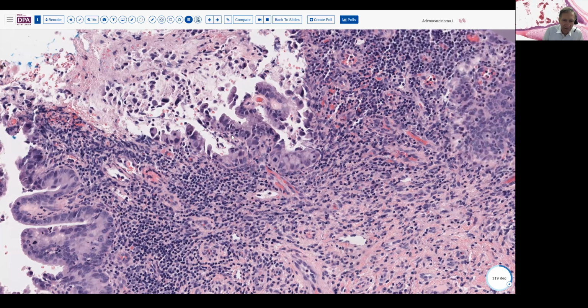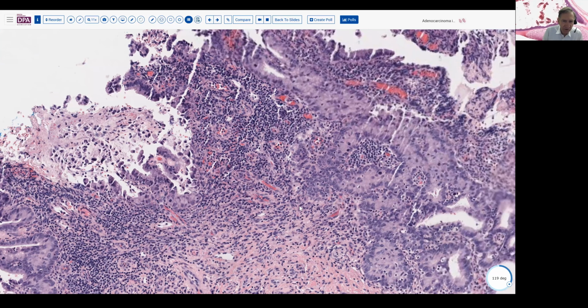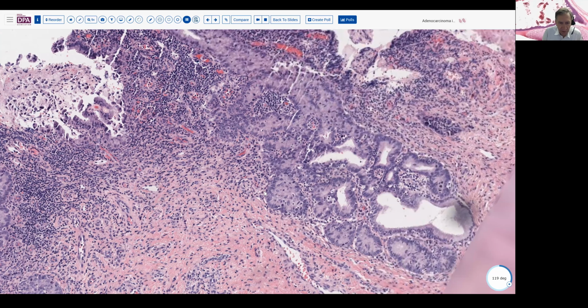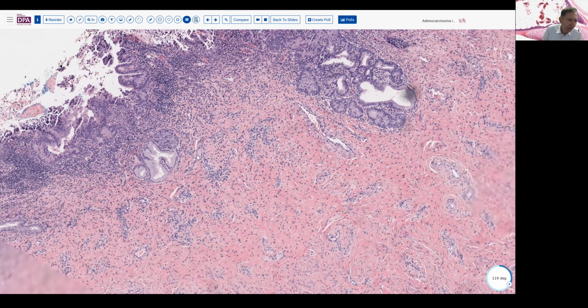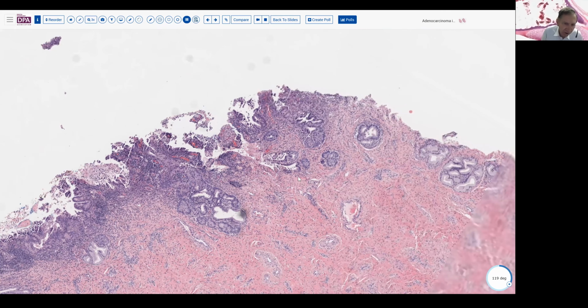Now, having said that, very focal superficial invasion has an excellent prognosis and would not require radical hysterectomy, of course. This here, I think, is still in situ involvement of a pre-existing gland. So maybe you could make the case that it's not all that different from what you're seeing here. But you could assert that it's either highly suspicious for, or may represent, very early invasive disease.